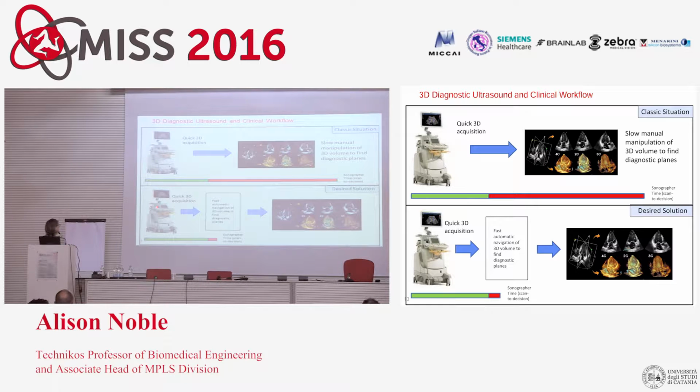So the time they would go from scan to decision is shown here, with green being the scan and red being the decision. The idea that you did a 3D scan didn't solve the problem, because they then had to manipulate a 3D volume to get the views they were trying to find. It was a very, very slow process to manipulate 3D volumes to find diagnostic planes.